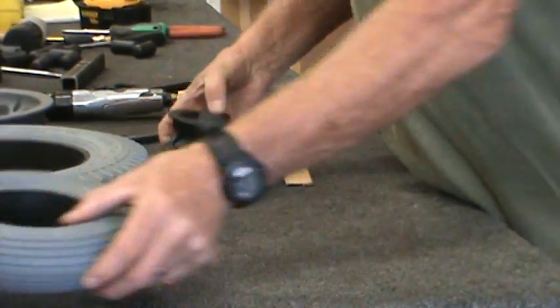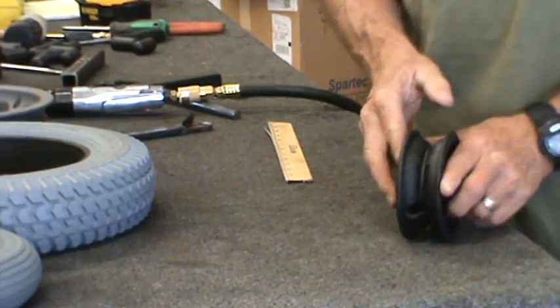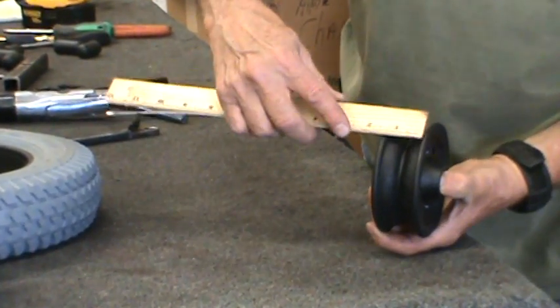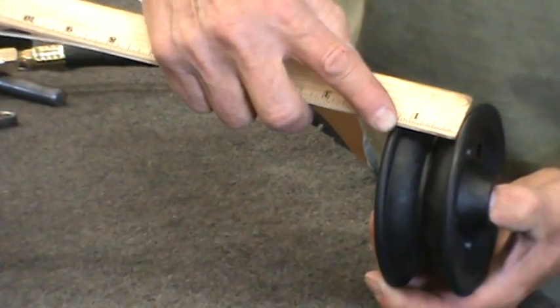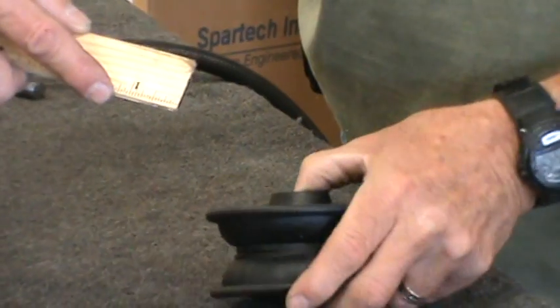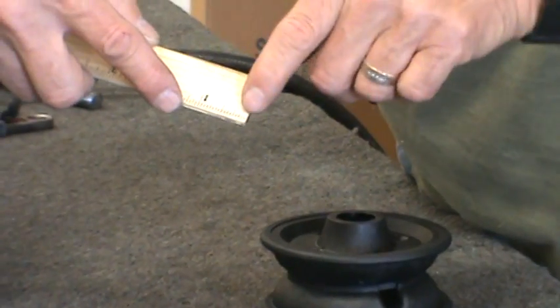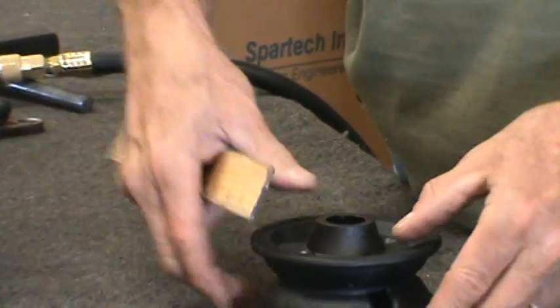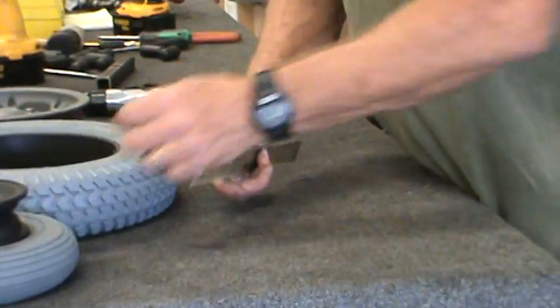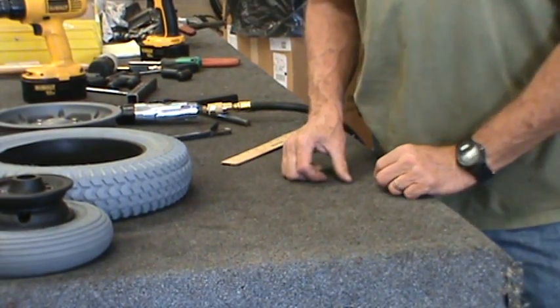Now you'll take your wheel. If you didn't have a tire and you wanted to get the right foam fill, you'd have to measure the wheel inside bead to inside bead, and this measures about an inch and a quarter. The foam fill is a little bit wider than the wheel, which is good because you need compression on there to hold the tire in a secure way.